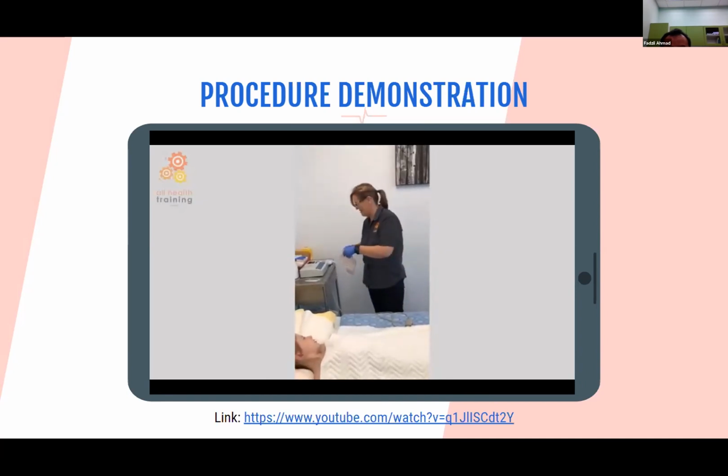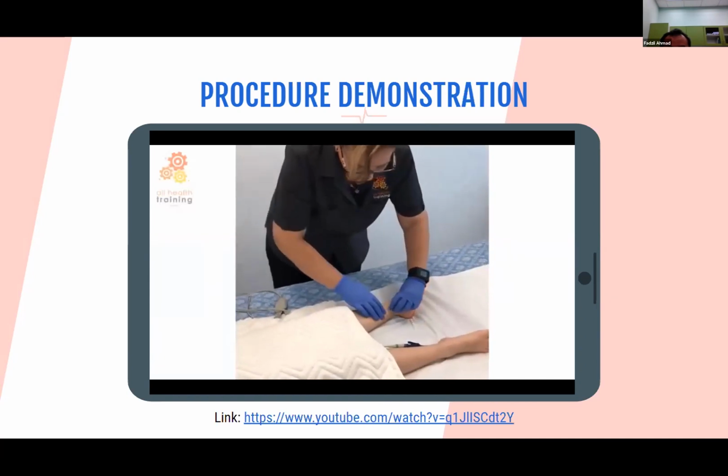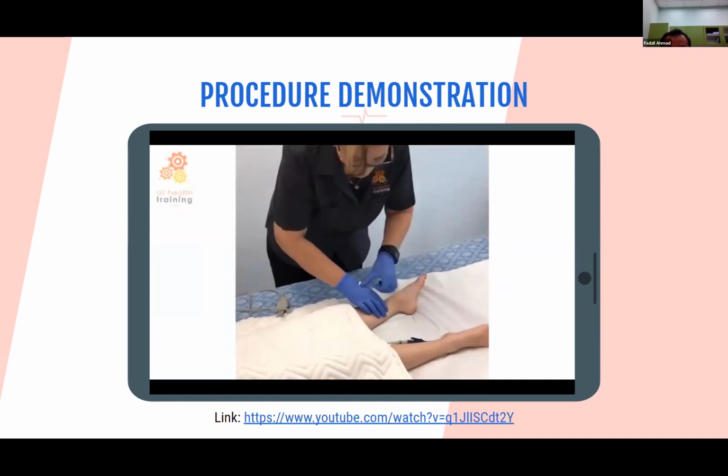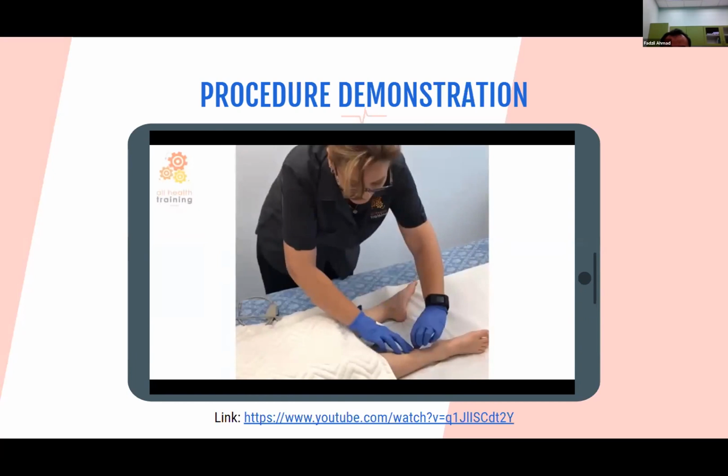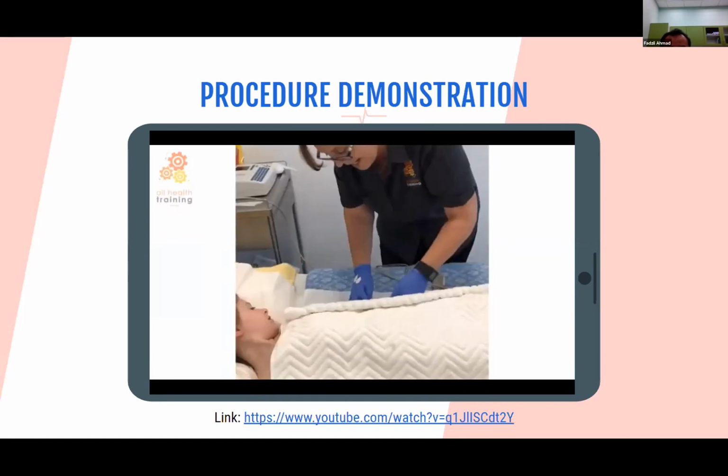Now we've got the trace. Well done. We unclip the wires from the electrodes, pull the electrode off, stick them to the glove on the back of the hand.